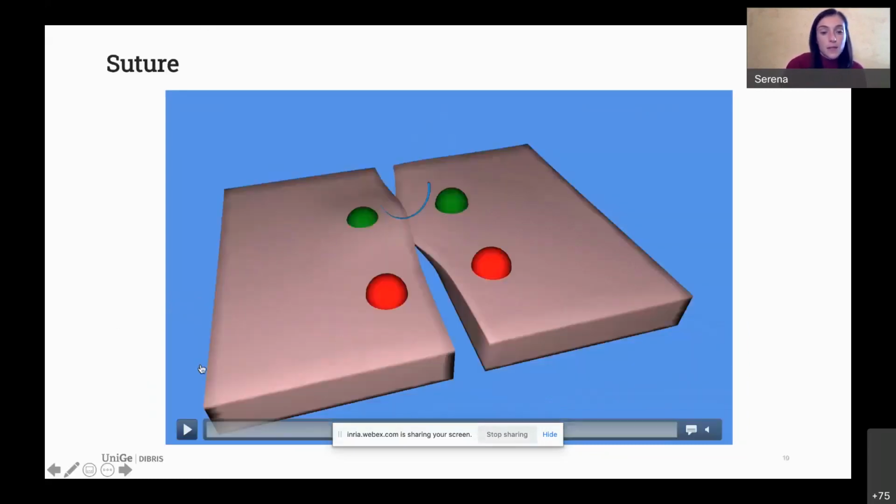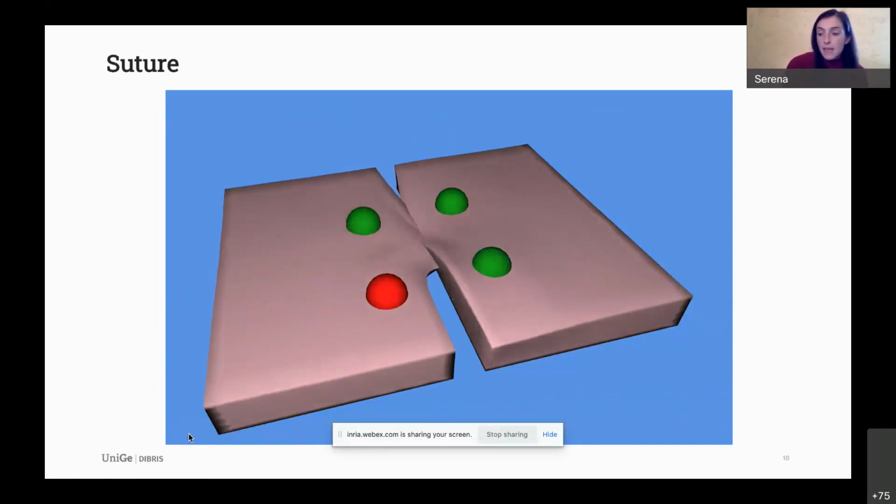For the second task, we implemented the suturing, and in this case, the user has to pass through some spheres we put, so that students could learn where to pierce the skin. The spheres also change color whenever the students pass through them in a correct way, and this is how the suturing looks like.